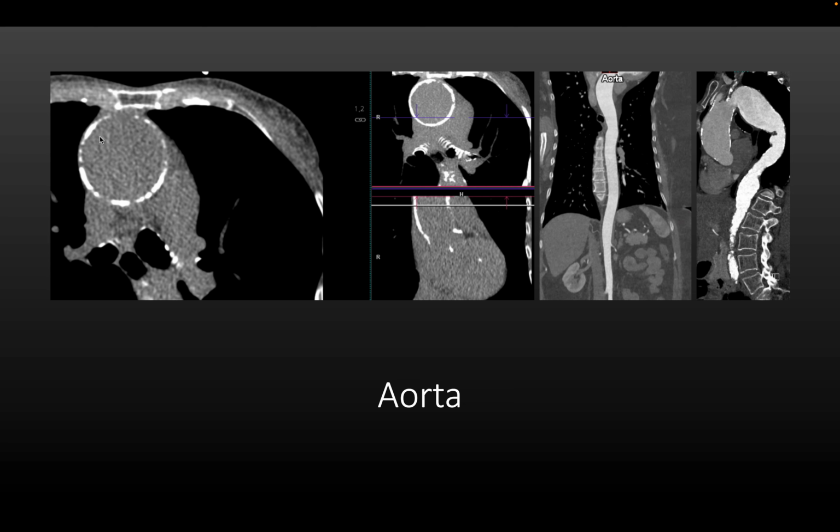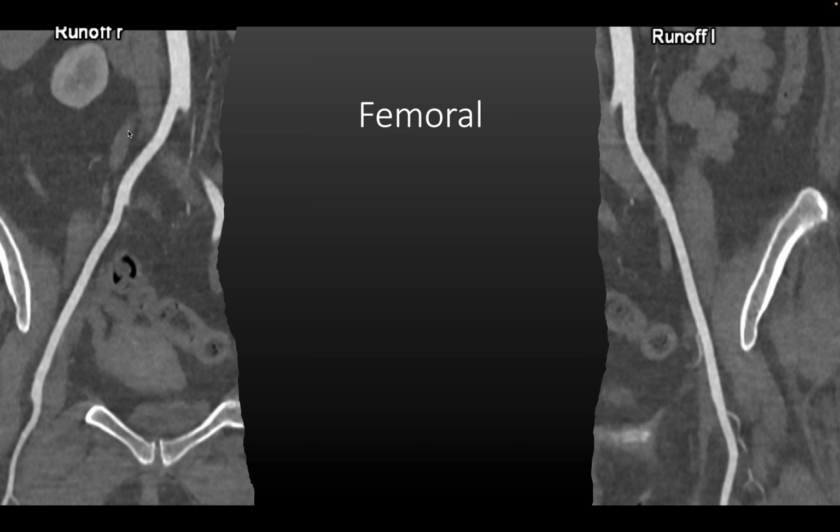Pre-operatively, sometimes it's important to check for aortic calcifications in order to guide for any puncture. So for example, in the heart-lung machine, sometimes they would puncture the ascending thoracic aorta from the anterior wall or from the anterolateral walls. So it's important to detect whether there is any calcification in those areas in order to guide.